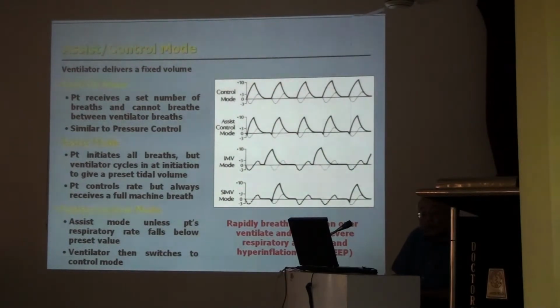Now I tell my machine that I will be on a ventilator. My mandated volume is 6 liters per minute. That mandate has to be given to the patient, that this patient will require 6 liters per minute by any chance. Now suppose I have taken huge alcohol at my conference, or a bottle of whiskey, and I get half drunk.